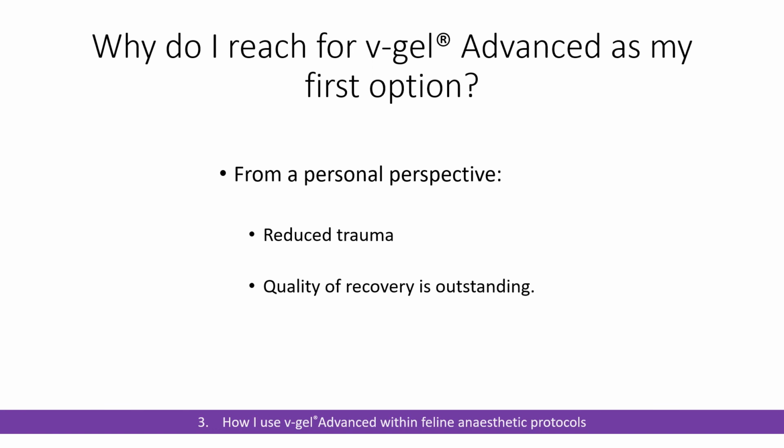I know that that mucosal trauma is unavoidable. It's not a question of my technique. It's not a question of my tube size or how well I lubricate the tube. When you touch the laryngeal and tracheal mucosa, you cause damage. And it's nice to be able to use an airway device that allows me to ventilate and maintain an airway effectively without touching the larynx and trachea.